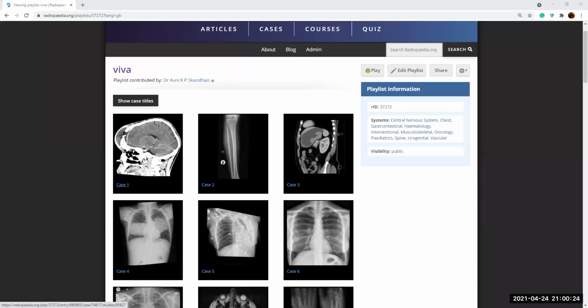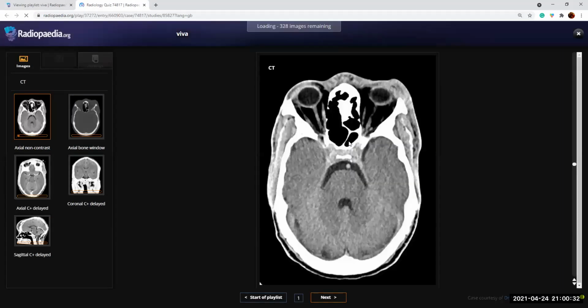Great. So I'll just start. Is the screen seen? Yes, it is. Okay. So we start the time? As soon as it opens, I'll start. Yes, I hope that is okay. Okay, Nilofer, so this is a patient who has a wound over the forehead and has had a procedure done for that before also. So I think you have the control. You want to start? I've asked. I have approved already. Okay. So my images are getting blurry. I'll start.